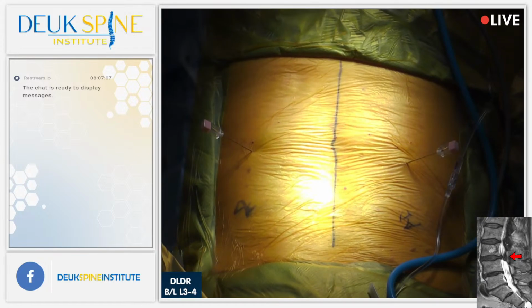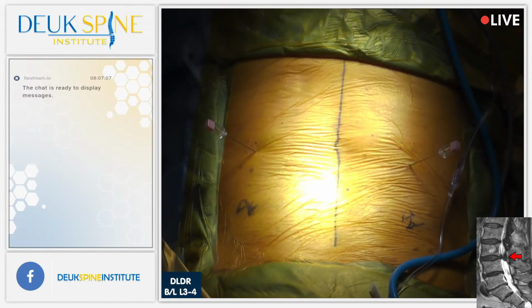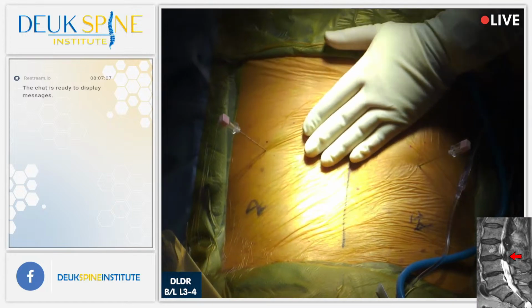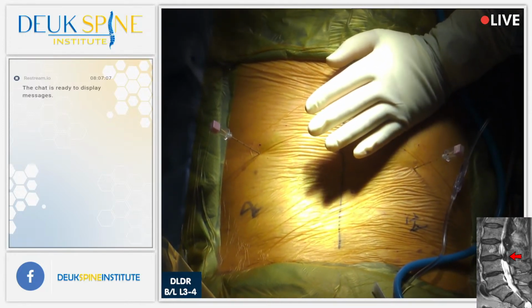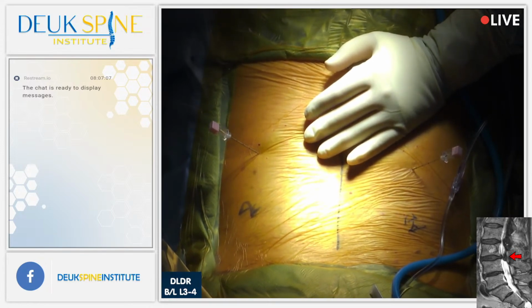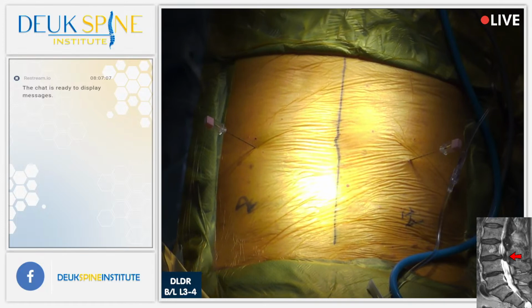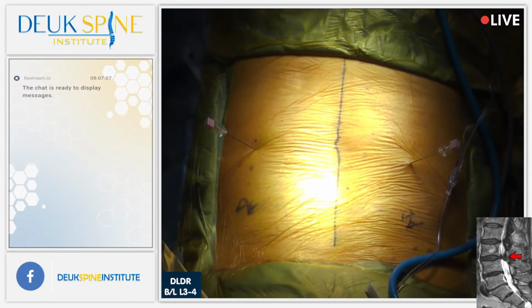All right, Dr. Berndes, are we ready? I'm waiting for my anesthesiologist. He needs to make sure the patient's awake for this part, because if I get too close to the nerve, and that would be the L4 nerve root at this point, then the patient will tell me, oh, I'm having pain in my leg. I need him to be able to tell me that, because if he can't, I could end up damaging the nerve and not knowing it. So it's very important that the patient's awake for this particular part.